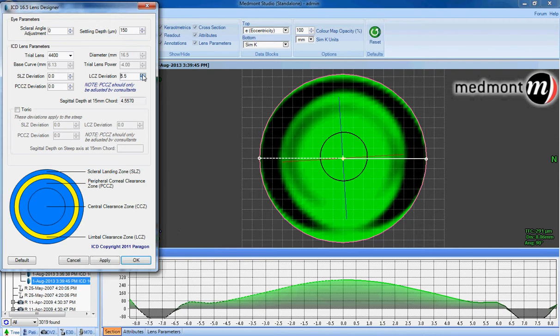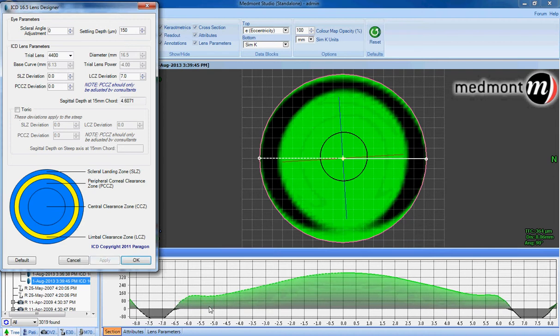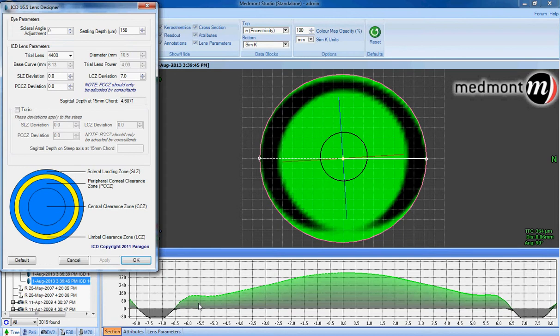It may be advisable to increase another two steps to limbal clearance zone plus 7 to have over 80 microns of fluid between the back surface of the lens and the peripheral cornea or limbus. With the limbal clearance zone plus 7, we can see a very healthy amount of fluid between the back of the lens and the surface of the eye.